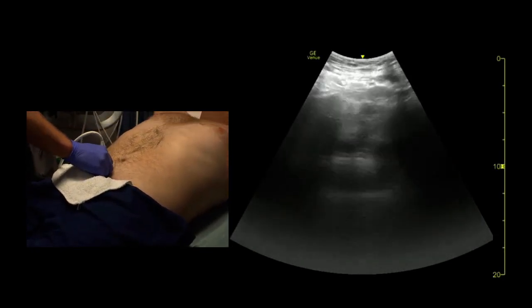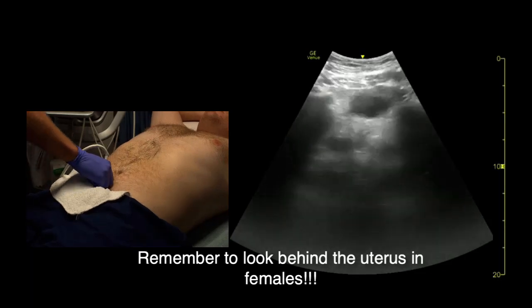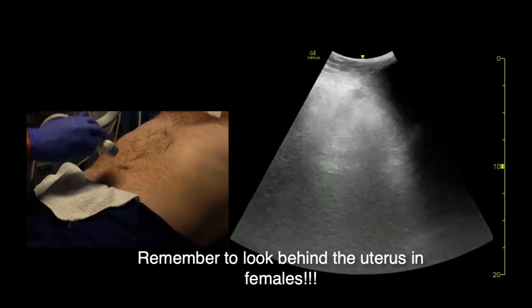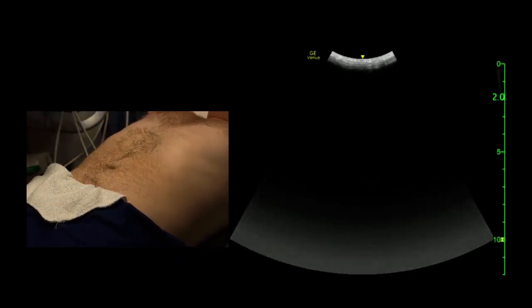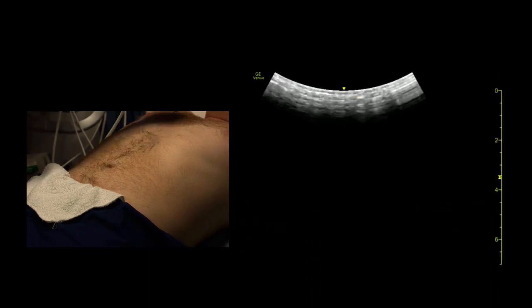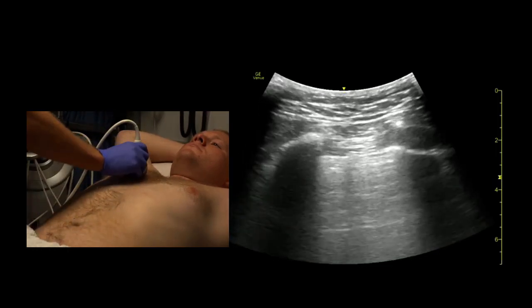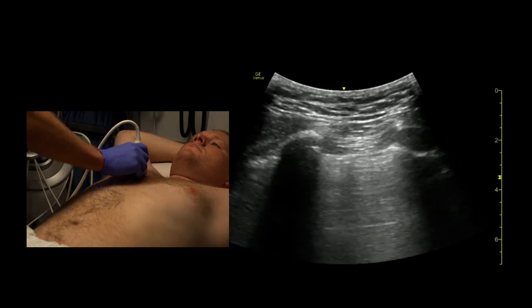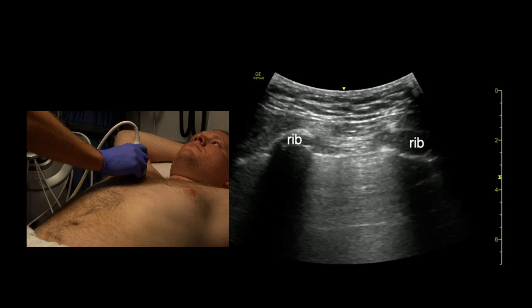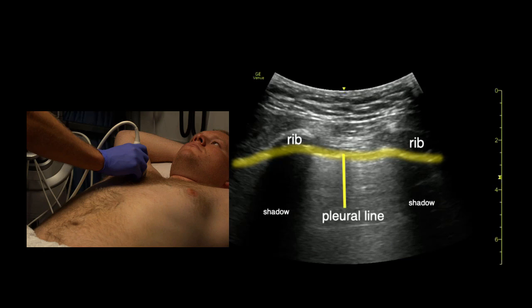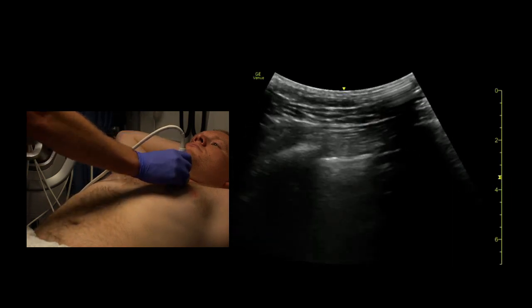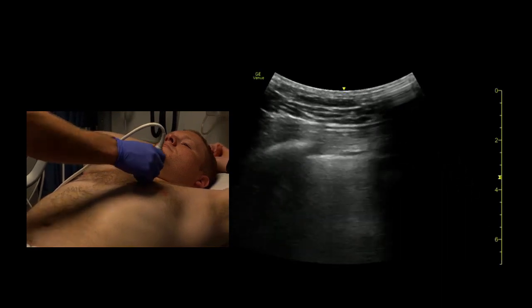Next we come over the bladder, indicator towards the patient's right, looking for free fluid behind or around the bladder. We fan down until it's gone and all the way up to the ceiling — no free fluid there. Lastly, we decrease the depth with the same transducer and look for pneumothorax on each side, going to the part of the chest closest to the ceiling and confirming we see lung sliding. We see ribs, ribs, and sliding on both sides. And that's our FAST exam.